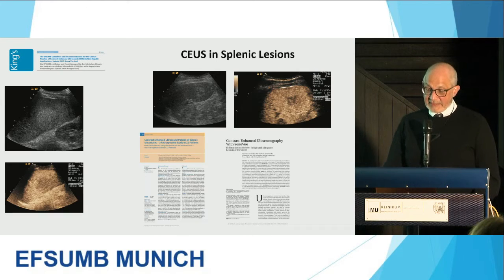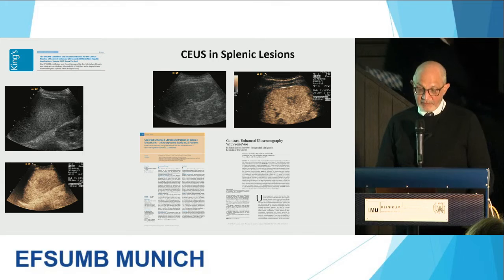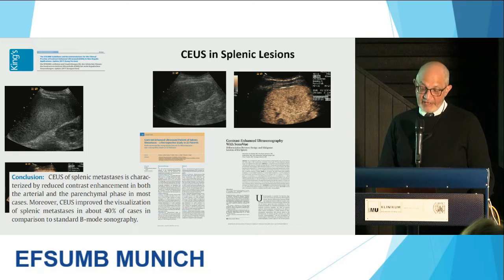So what about the evidence for splenic lesions? Well, there's not a lot of literature out there. These couple of papers I've picked up from the literature show a couple of things. This one, with only 30-odd patients in the retrospective study, showed that contrast improved the visualization of splenic metastases in about 40% of cases. So it's not telling you it's going to do it really well.